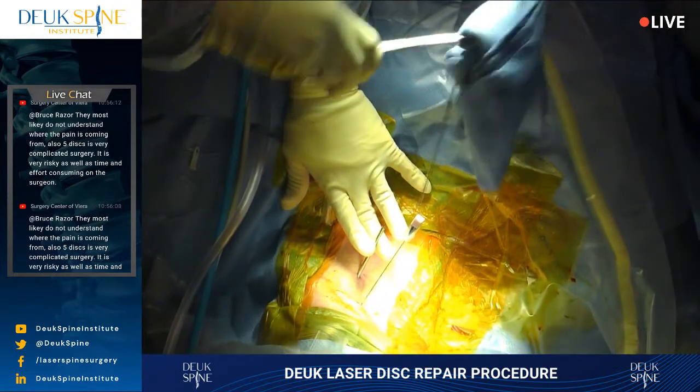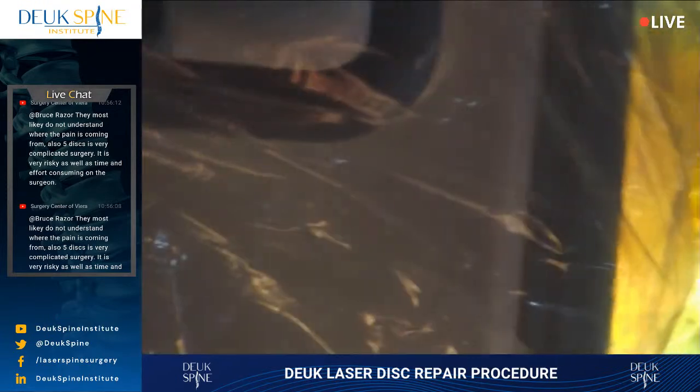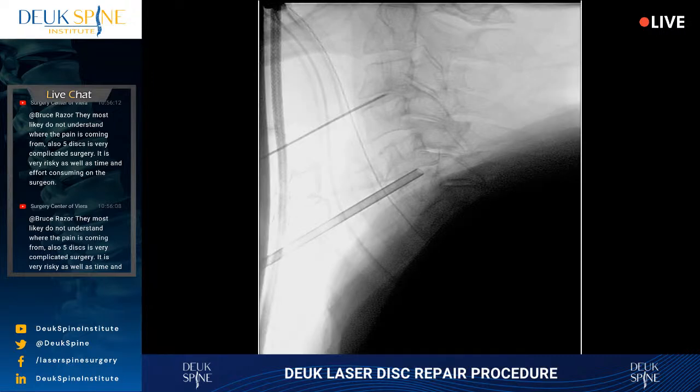All right, so there we are with our tube at the back of the disc. Kind of hard to tell because of the angle, because he has some scoliosis of his spine. But that said, I'm very happy with where we are, and our C3-4 needle is still in good position. So we're gonna get this C5-6 disc done, and then we'll head over to the C3-4 for our last disc for this surgery. Okay, this tube, I like the tube to be facing away, like this way. I think we got too much tube, but that's fine.